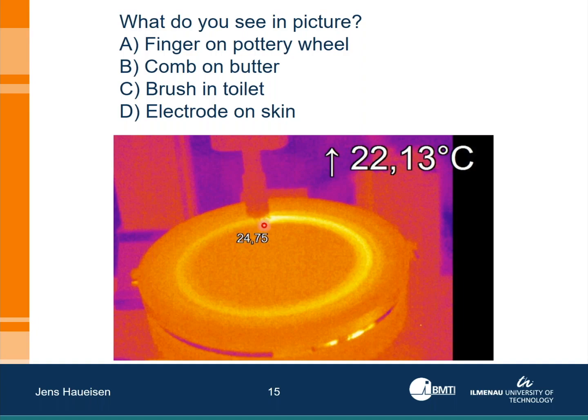So you see actually the fingers of the electrode, it's a soft one, being a bit tilted. And that is because there is a pressure of about 3 Newton pressing the electrode onto that rotating artificial skin. The artificial skin is a silicon-based material, which is used otherwise. We just adapted it from the literature. And we use this here to actually do testing for the stability of the coating.